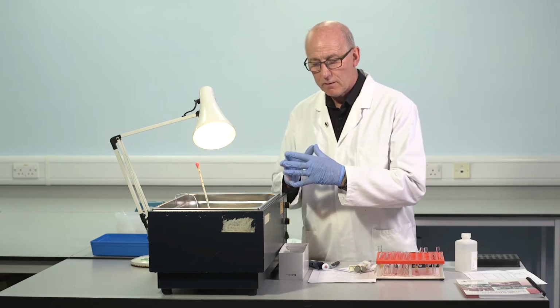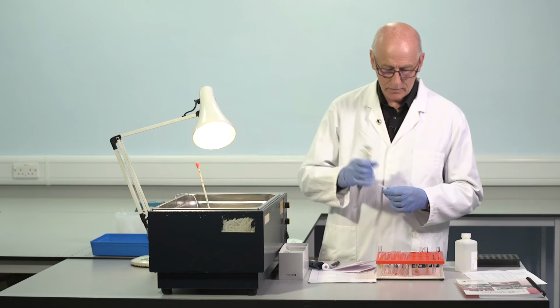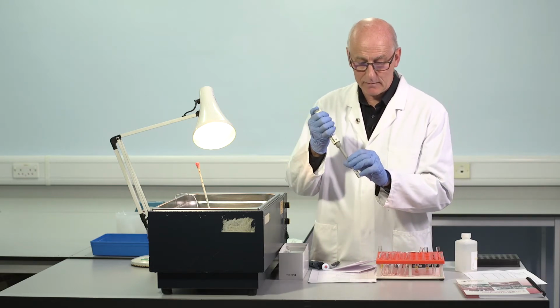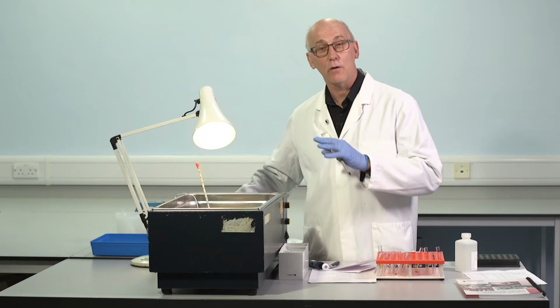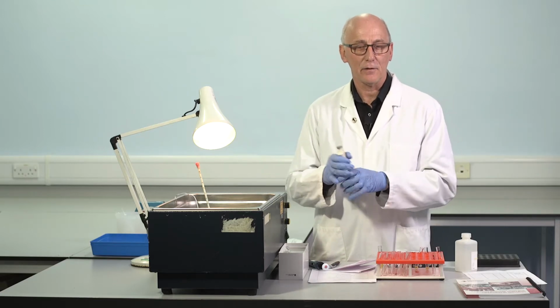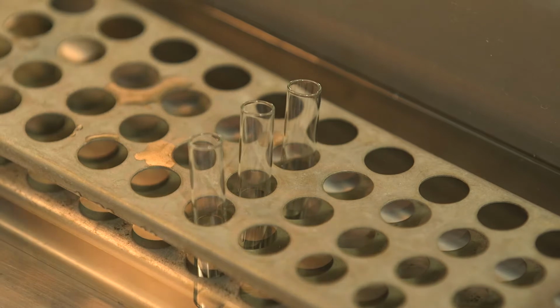0.1 of factor VIII deficient plasma. To the first tube, we're going to add the same volume, 0.1 of 1 in 10 dilution of standard. Goes in the first tube. It's simply warming up at the moment. There's no reactions occurring. Factor VIII deficient plasma, dilution of standard, 1 in 10, and in this next tube, 1 in 20.